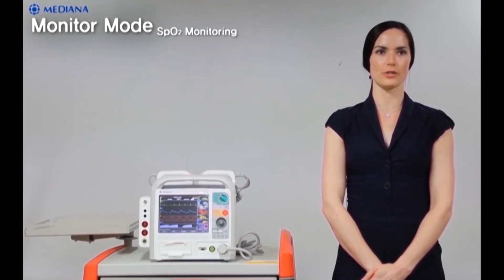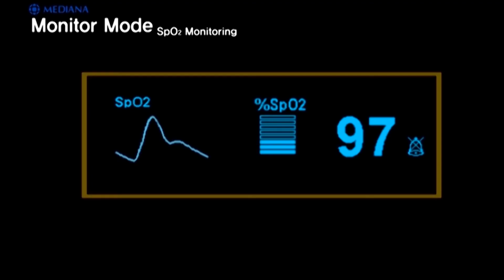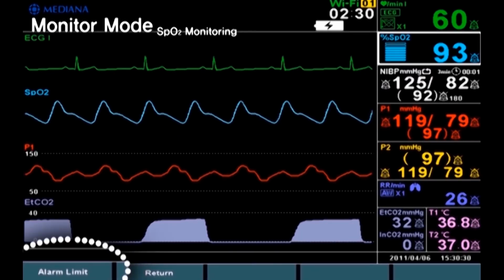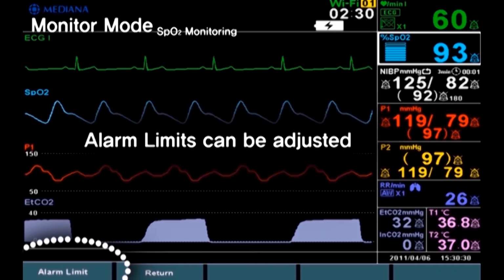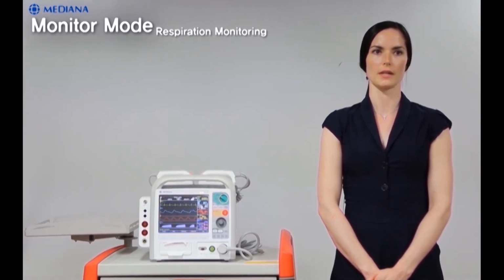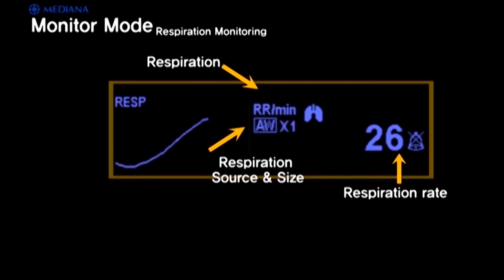Next, to SpO2 monitoring. Here you can see how the SpO2 measurements are presented on the screen. In the SpO2 menu, we only have the alarm limit settings. Number 1, the alarm limit can be adjusted. Now, let's move on to respiration monitoring. Here you can see how the respiration measurements are presented on the screen.